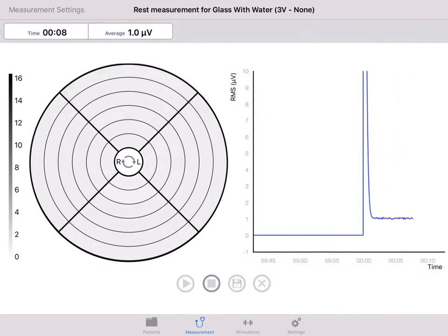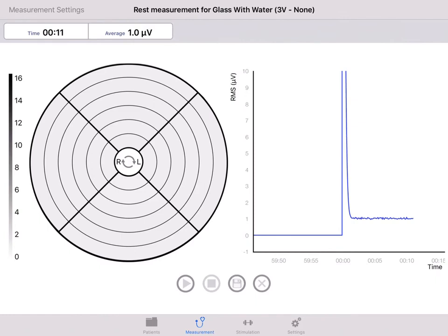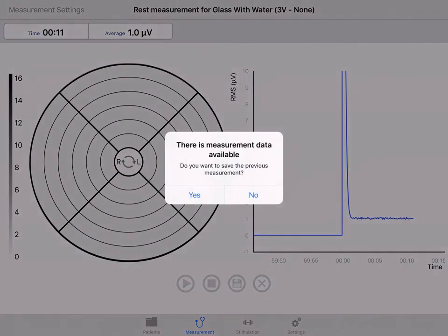To stop the measurement, select the stop button. A new measurement can be started immediately by pressing the start button again. The system will ask you whether or not to save the previous measurement.